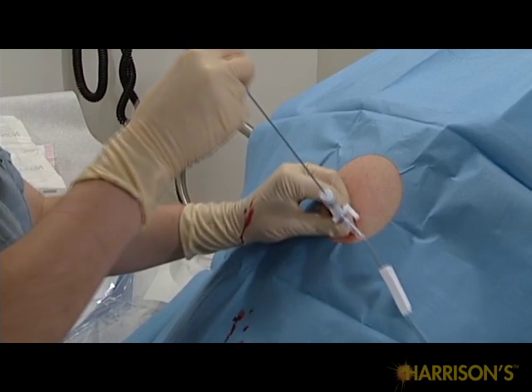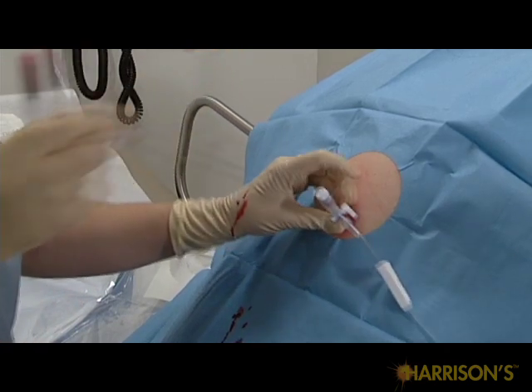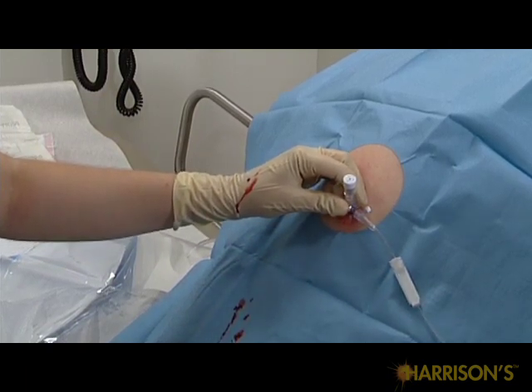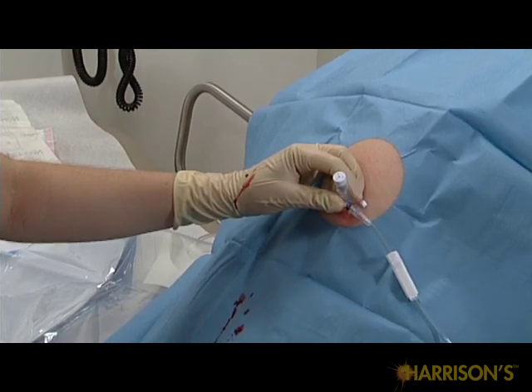Aim the catheter to the dependent portion of the posterior costophrenic sulcus for maximum drainage. Do not bend the catheter over the rib, as it will kink and will not drain well.